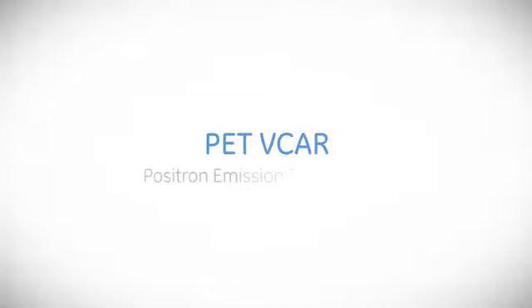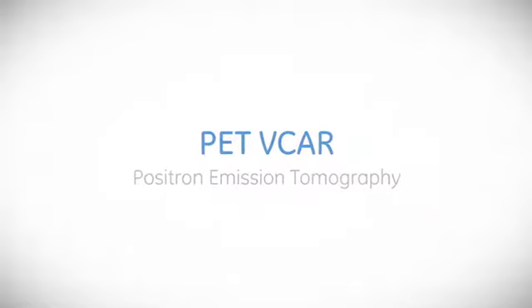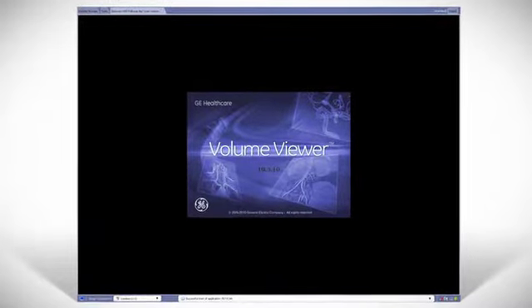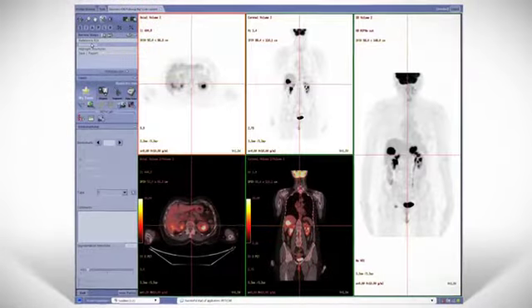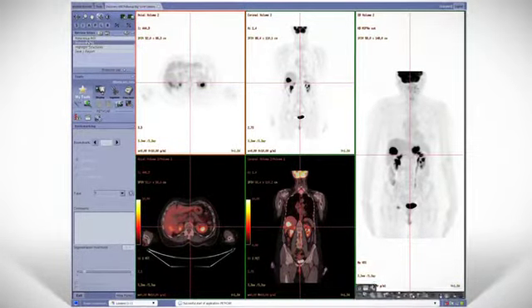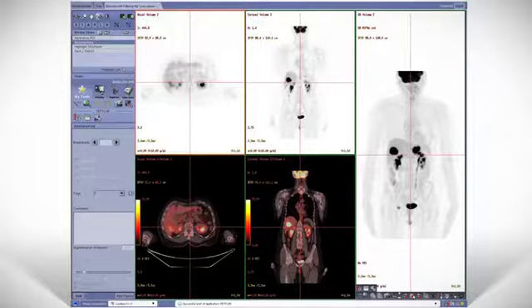As an integral part of the DEXIS seamless workflow environment, PET-VCAR is a PET-CT application optimized for visualization and analytical monitoring of disease progression or tumor response to treatment, assisting clinicians in diagnosis, staging, treatment planning, and monitoring treatment response.